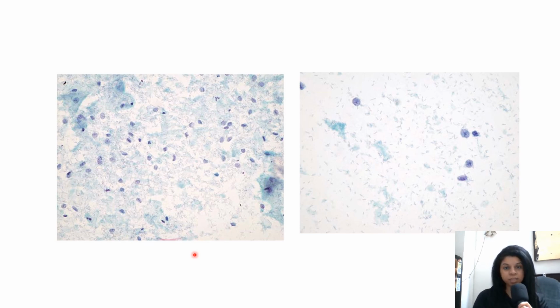So what are we seeing in this slide? Since the patient is day 17, this is a secretory phase. So it is important to check on the LMP and know which part or day of the menstrual cycle the patient is in. That also says a lot about the clinical history, which you have to narrow down and have a clinical scenario in mind, and then you are going to look at the slide.